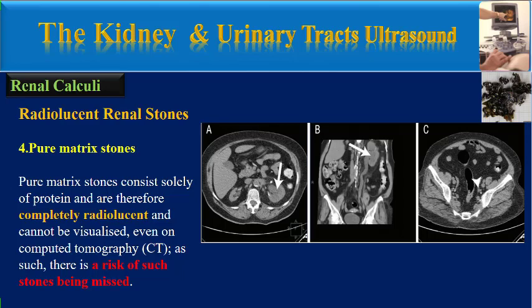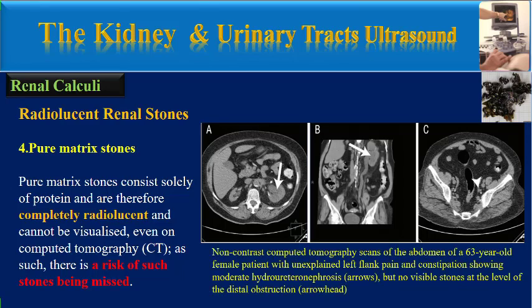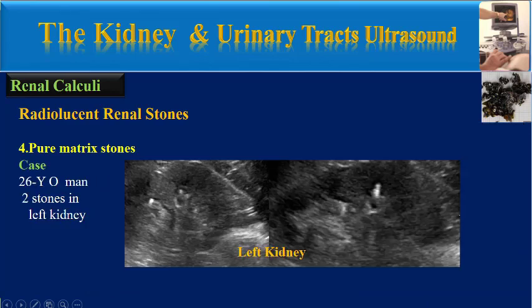This is an example of a pure matrix stone in a 63-year-old female patient with unexplained left flank pain and constipation, showing moderate hydroureteronephrosis but no visible stones at the level of the distal obstruction.